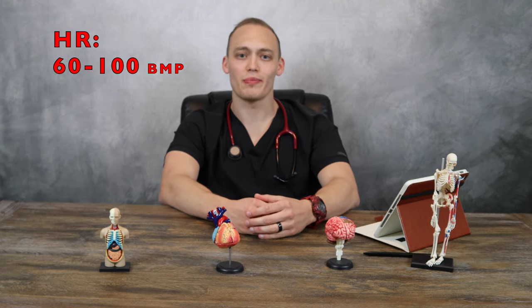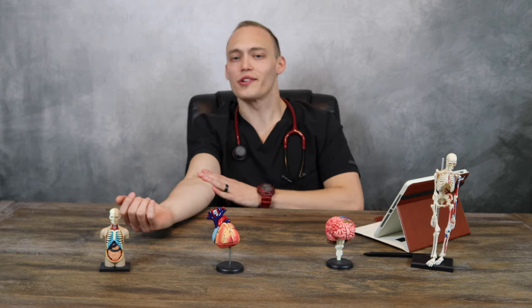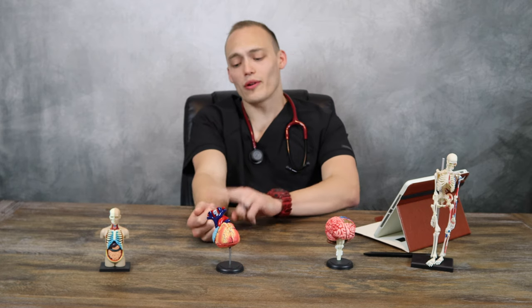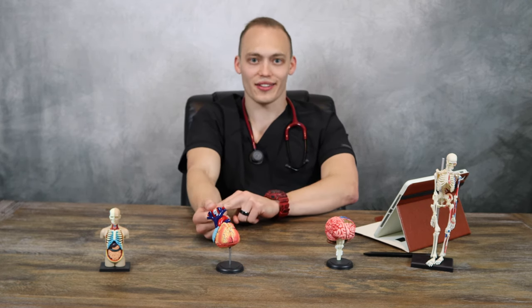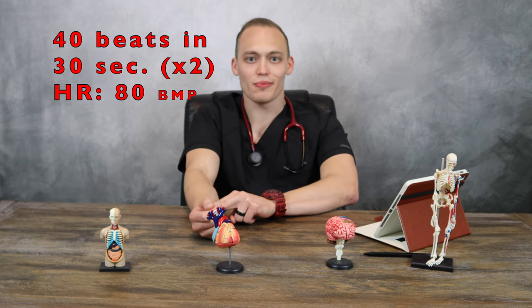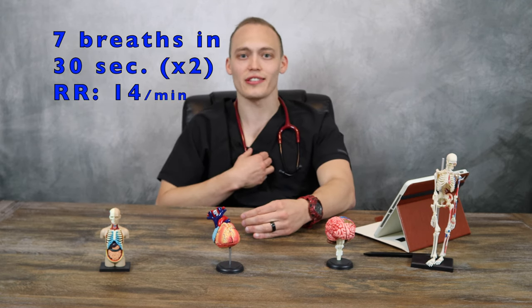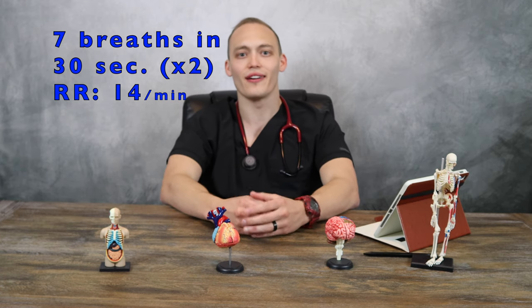After pain, I like to do heart rate and respiratory rate. A normal heart rate in an adult is anywhere from 60 to 100 beats per minute — that's how many times the heart squeezes in one minute. Respirations are also measured in how many breaths you take in one minute. I like to assess them simultaneously for one minute. A heart rate can be assessed at the radial artery, brachial artery, carotid artery, or you can use your stethoscope. In one minute, I count the beats in the first 30 seconds, then count respirations in the remaining 30 seconds. If I count 40 beats in 30 seconds, I multiply by two for a heart rate of 80 beats per minute. Same with respirations — if I count 7 respirations in 30 seconds, that's 14 breaths per minute.